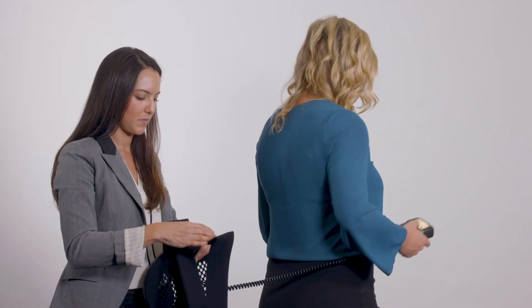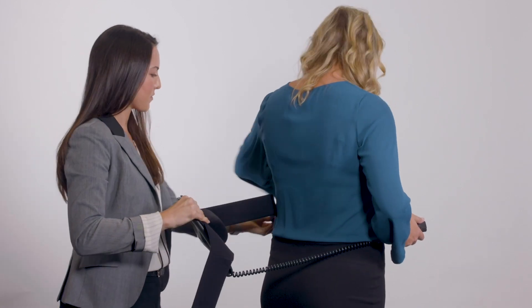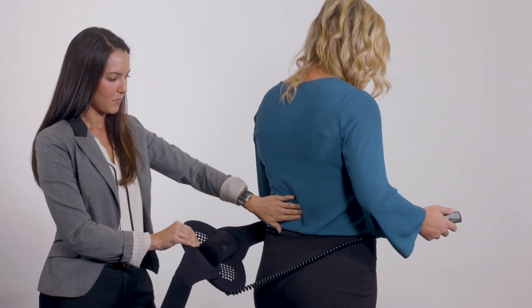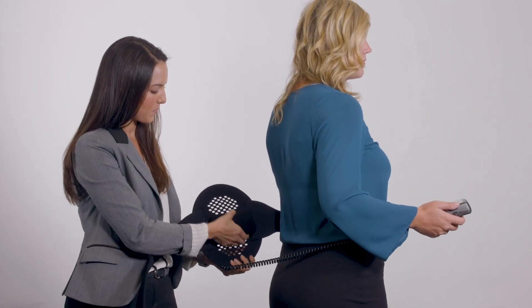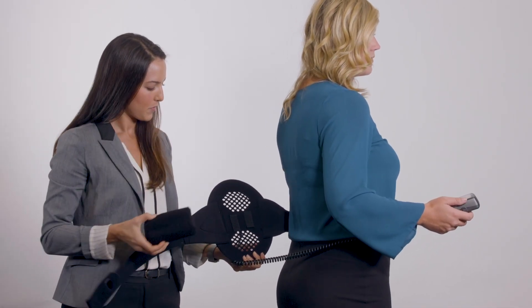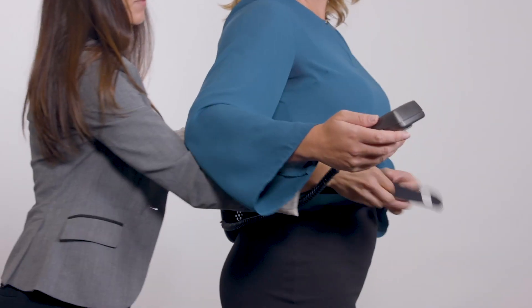Open the waist belt and align the center of the coil with the center of the fusion site. If necessary, you may choose to apply the small black pillow to the center of the device to fit comfortably in the curve of your lumbar spine. Velcro can be found in your carrying case if needed. Secure the waistband comfortably.